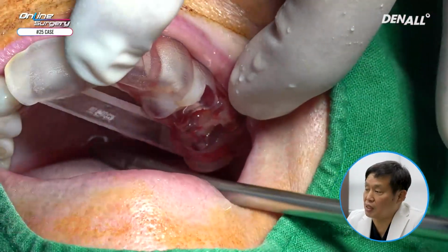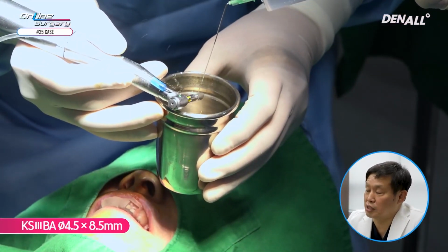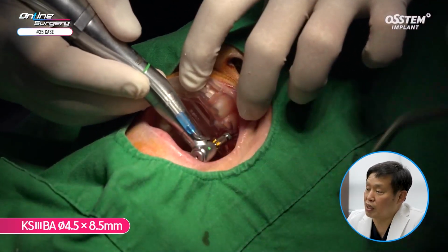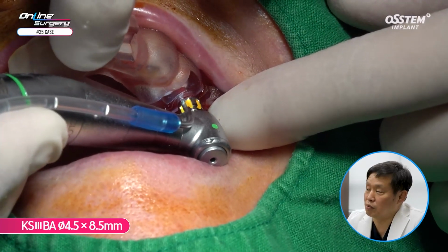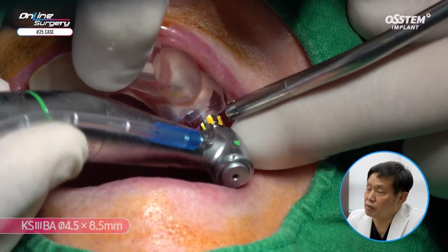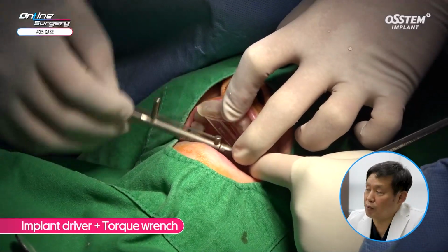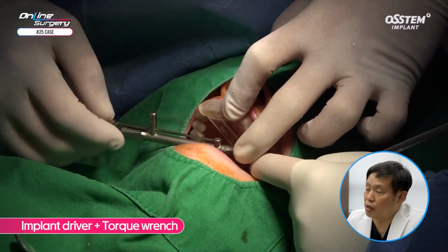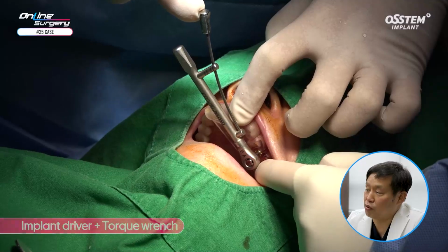The KS3 BA surface 4.5 by 8.5mm implant is placed. Because it is BA surface, saline is used to irrigate it sufficiently. The implant is placed about 80% using the engine. Primary stability is rather favorable, over 30 Newton centimeters. It looks sufficiently stable. You can see that the implant has been nicely placed.